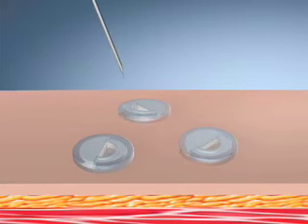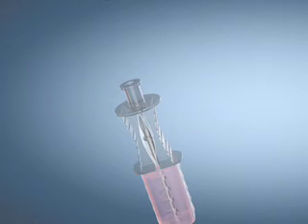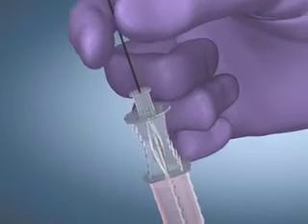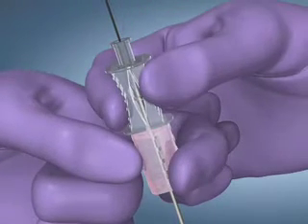Insert the safety introducer needle into the gastric lumen directed toward the pylorus. The best angle of insertion is a 45-degree angle to the surface of the skin. Use endoscopic visualization to verify correct needle placement. Advance a guide wire through the introducer needle into the fundus of the stomach and confirm position. Remove the safety introducer needle, keeping the guide wire in place, and activate the safety collar.